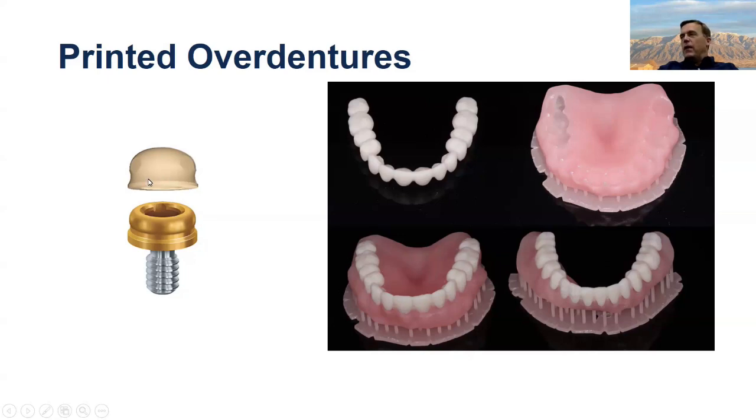So if you use the scan body, what it'll do is it'll make a very precise hole in the intaglio of the denture, and you'll go ahead and place the female attachments chairside. So another thing to keep in mind, because I think you'll really see the benefits in terms of decreased staining, decreased breakage, better fit, more comfort for your patients.